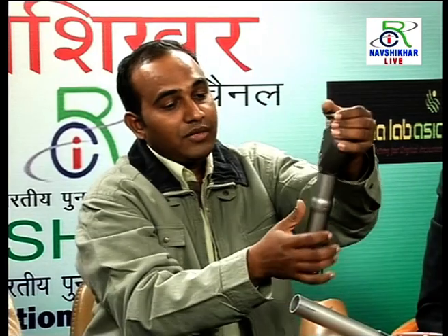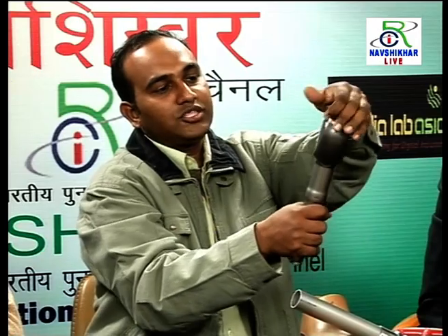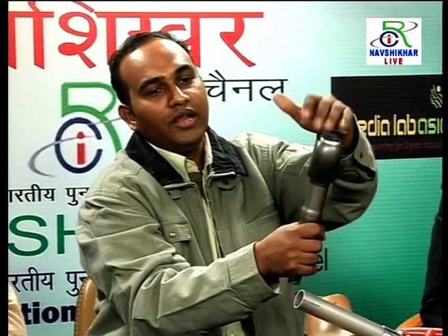But a pneumatic system will be filled with air, so it will definitely be lightweight, and it will also give you a smooth movement. But in spring loaded, what happens? Spring loaded will give you a jerky movement, because the spring action gives you a jerk. So every time it will jerk.